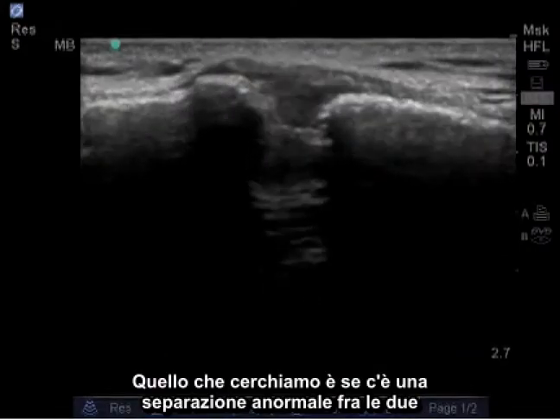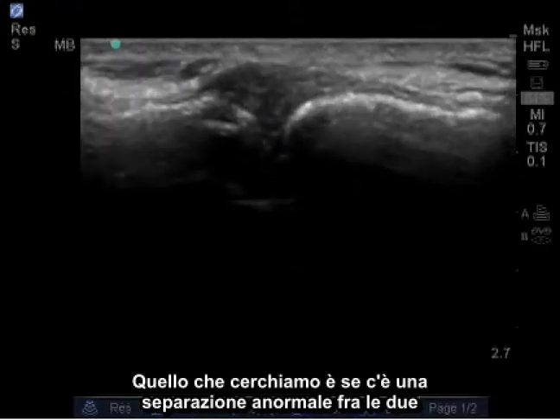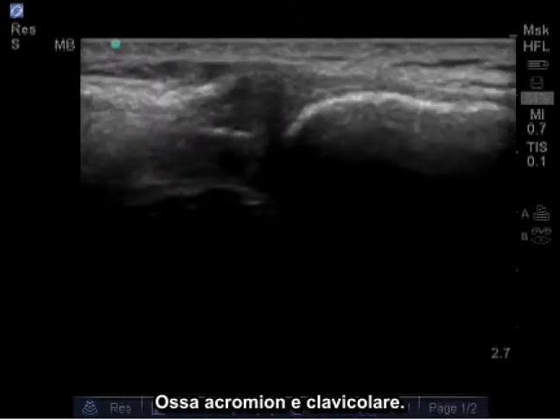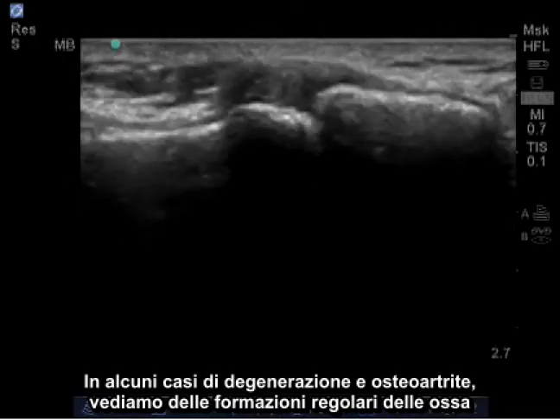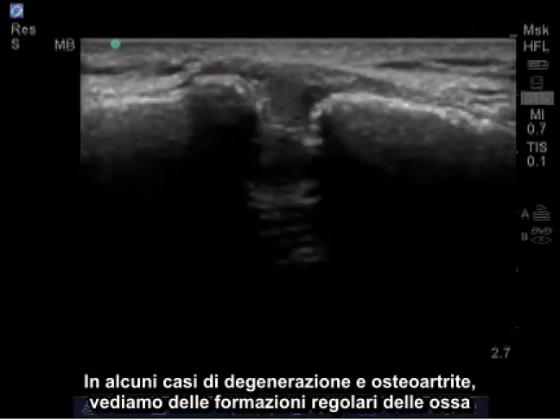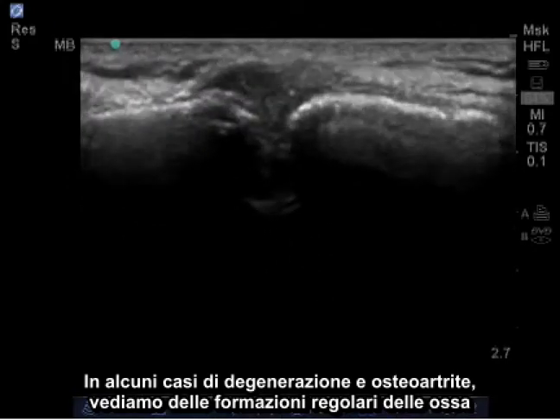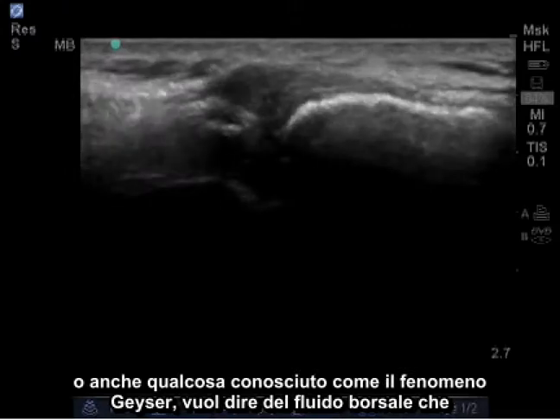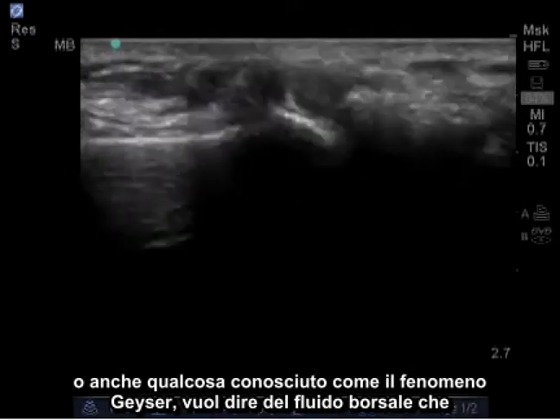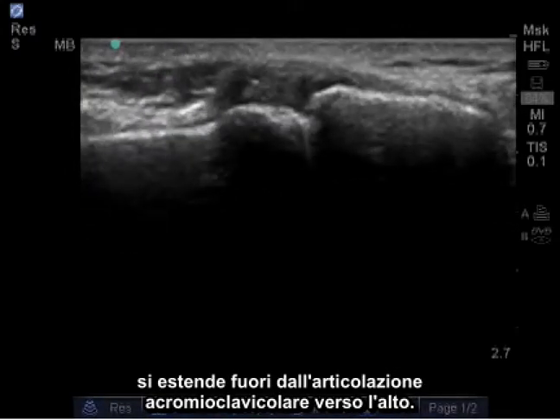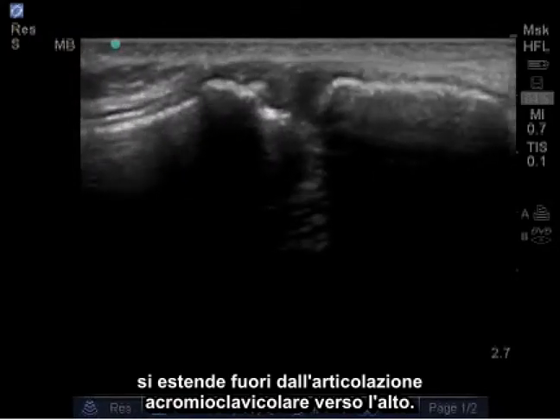What we look for is any abnormal separation between the acromion and clavicular bones. In some cases of degeneration and osteoarthritis, we'll see irregular bone formations or even something known as the geyser phenomenon, which is bursal fluid extending out of the acromioclavicular joint upwards.